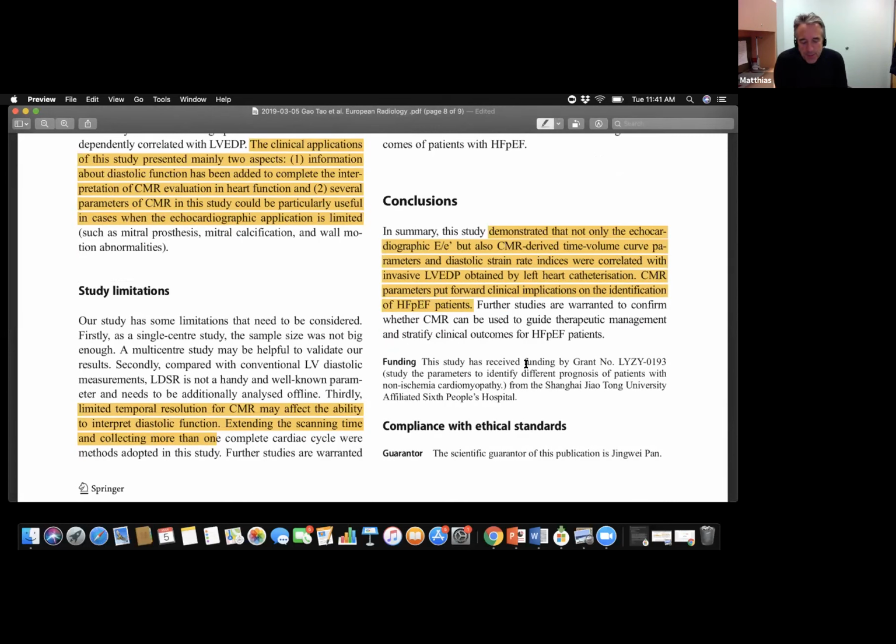From a high-level point of view, Nigar, you're also doing a lot of echo. So of course, some of the concerns would be, first of all, that the scatter of some of the data points seems pretty significant. And then the other maybe major concern to be discussed would be, is the temporal resolution really good enough?